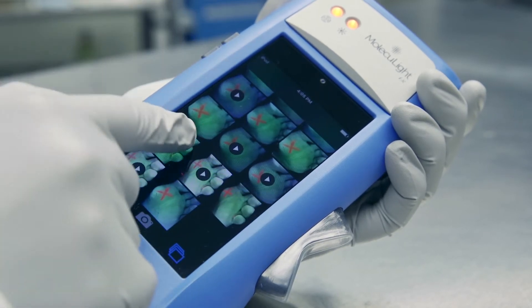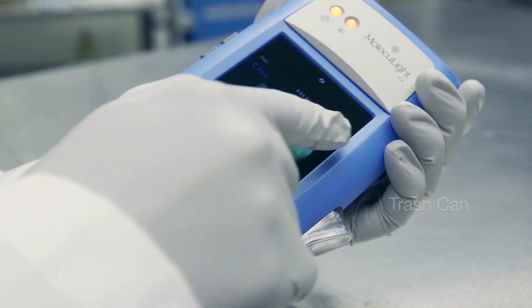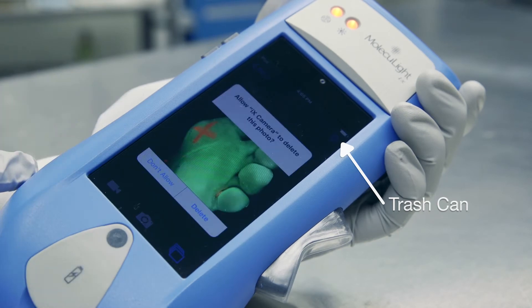To delete an image, simply select an image, click on the trash can, and then confirm.